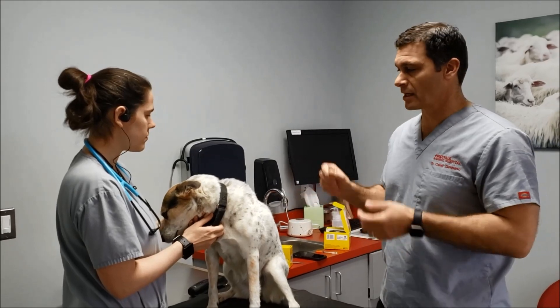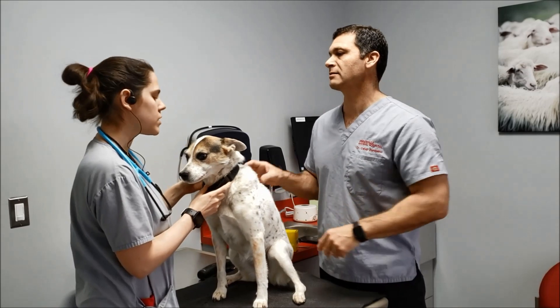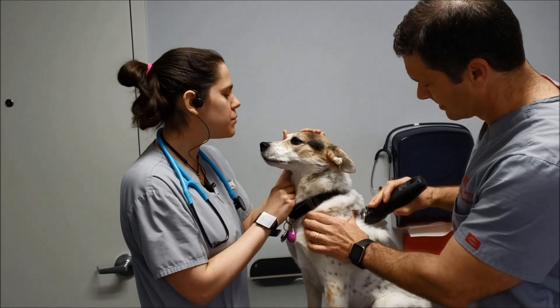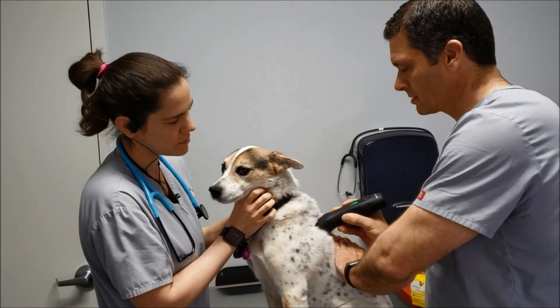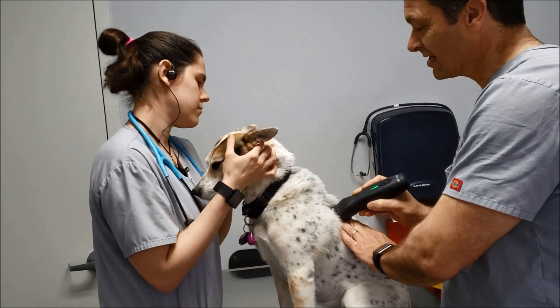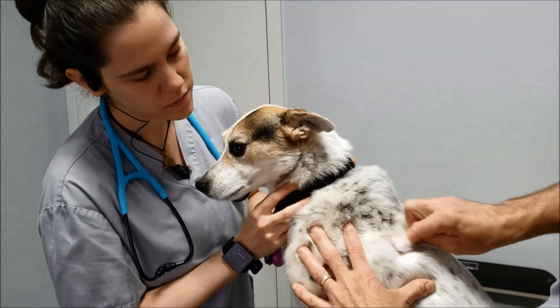We're going to show you how we apply it and how we can start getting readings. We can put it on the side or on the neck — Allison prefers the side. So we're going to shave a little patch — we don't need a lot of space, about the size of a half dollar coin. We need to get all the hair out of the way so it adheres, and then do a light cleaning with some alcohol to get the oil off the skin and let it dry.